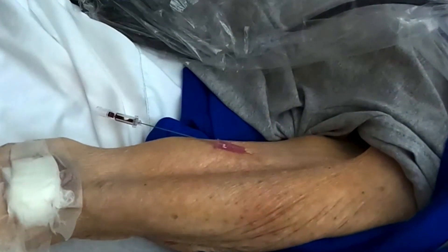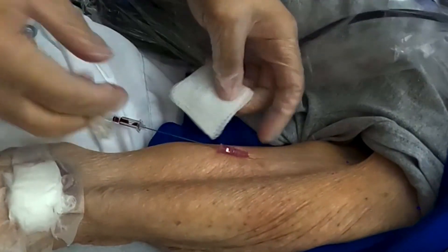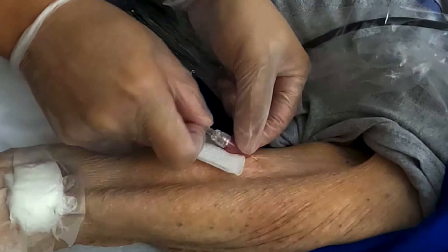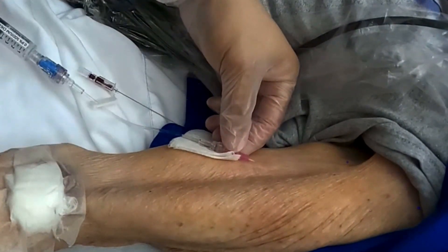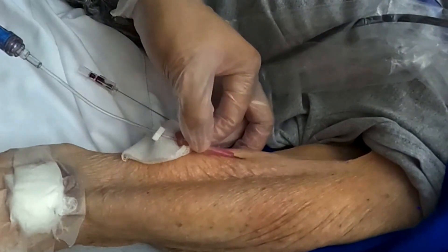Okay. Now I should have gotten more blood return, but I didn't. So I'm kind of concerned that we didn't puncture, or we punctured through somewhere. That's supposed to work. I'm not getting good blood return.